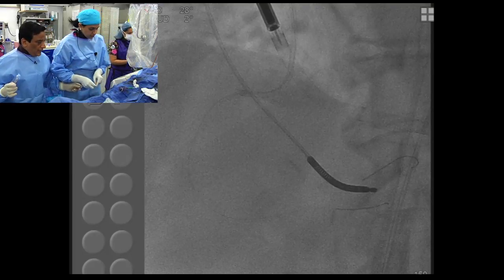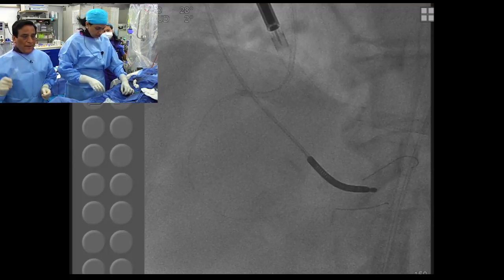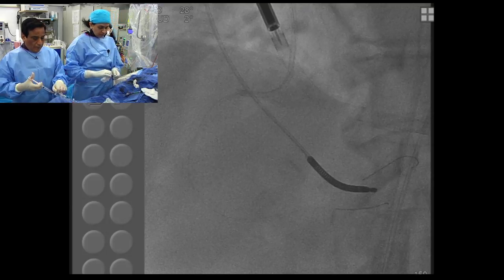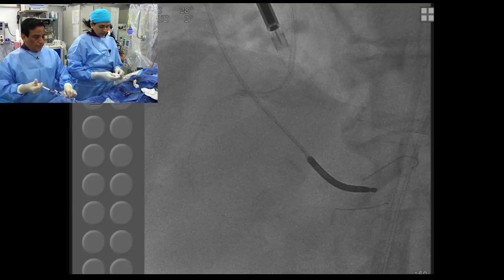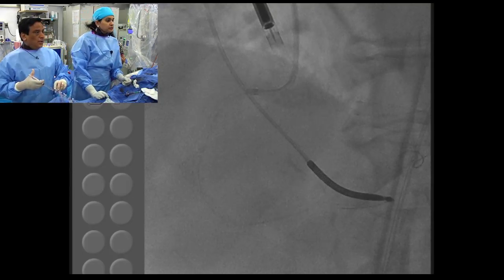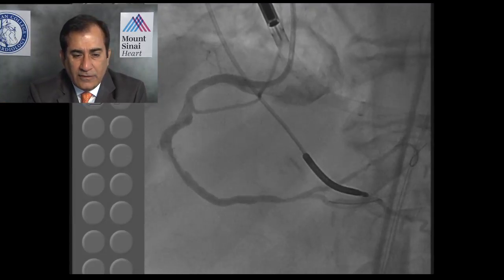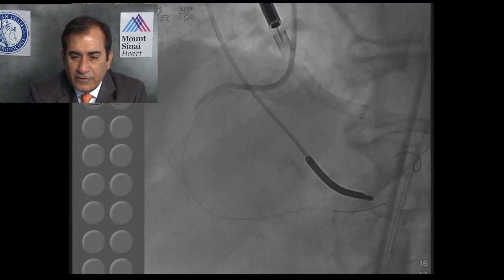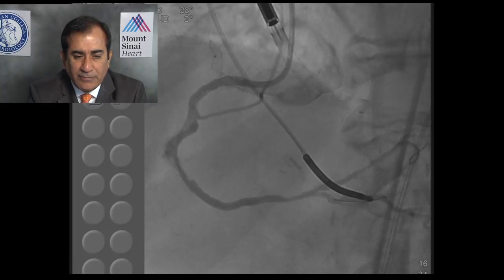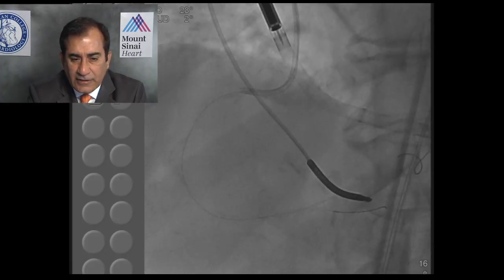To me, the role of the Impella is in high-risk complex PCI. Anecdotally, people may use it, but based on the available data and literature, I cannot support its use in cardiogenic shock patients. As a guiding point of some value to operators, if you are using it for STEMI with cardiogenic shock, it is more important to put the Impella in first and then go after the culprit lesion.